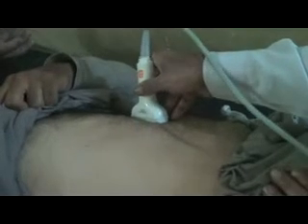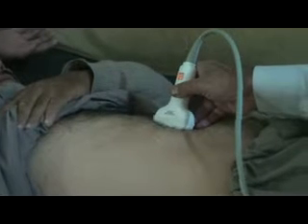Now when I place the probe straight, you have to angle it towards the shoulder of the patient or the axilla of the patient, little angling anteriorly, wherever you get the gallbladder.